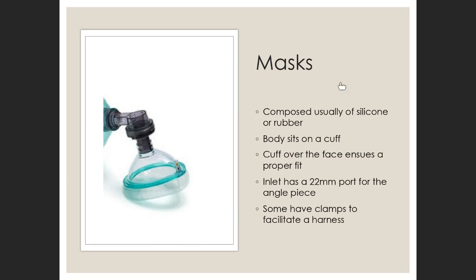Let me see if she has another one. Yes, Jessica. Talk up, please. Hi, Doc. I was wondering which one of the two is easier to place, the normal tracheal tube or the laryngeal mask airway? Okay. Question on the floor, guys. Everybody heard the question on the floor? I want to hear what you think. I should have polled you with that. Don't answer me yet. Hold on. You can close your mic, but we'll come back to you.